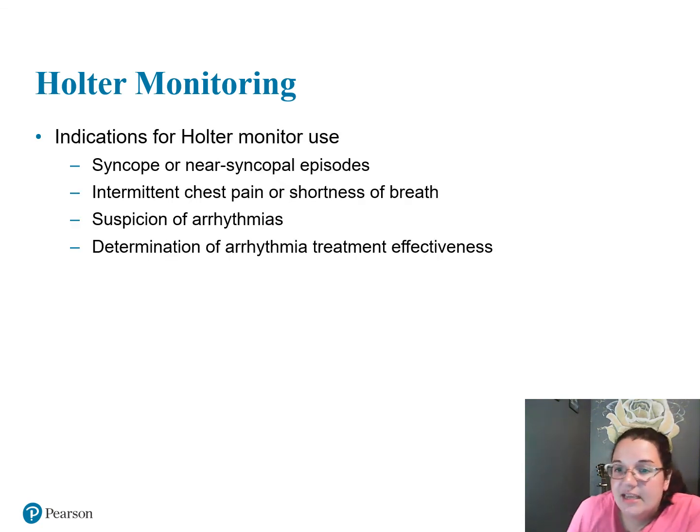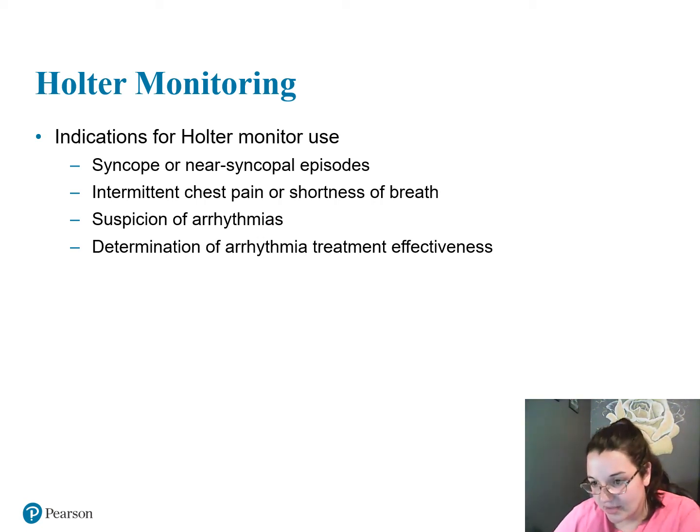So what are some indications for a Holter monitor use? So again, are we just going to put a Holter monitor on anybody? Somebody healthy, no family history, and they want to come get a Holter monitor? No, we have to have symptomatic, right? So normally the indications to use a Holter monitor is somebody who has syncope, meaning they pass out, or they have near syncopal episodes, meaning almost every day they experience the possibility of passing out.